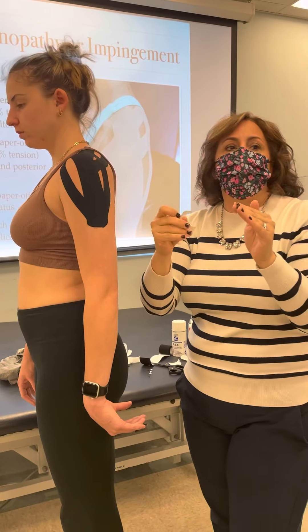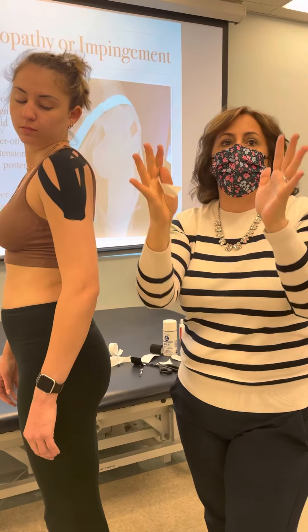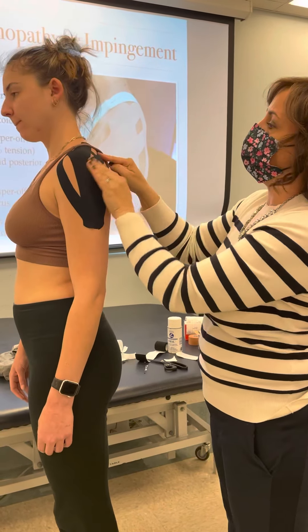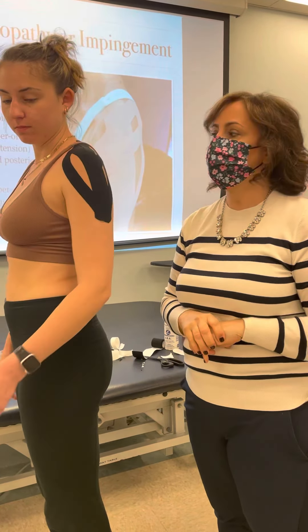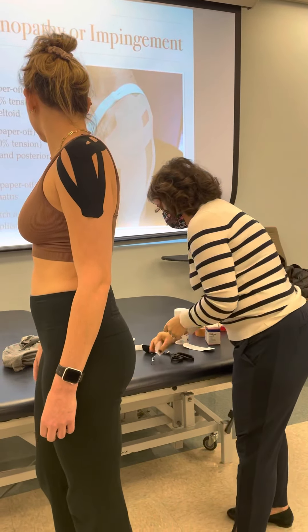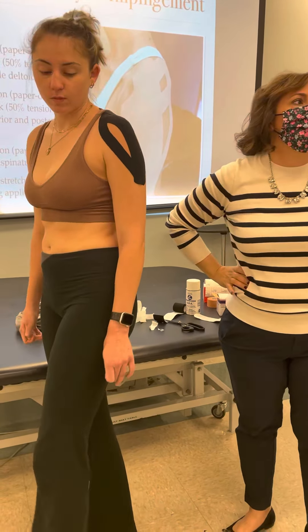It's the same concept as with the gastroc head — you supported around the gastroc heads to kind of give them a lip. Here it's the same concept: give it a good rub and then they're ready to go. I just wanted you to see that this one was a little different, but it works on the same principles.